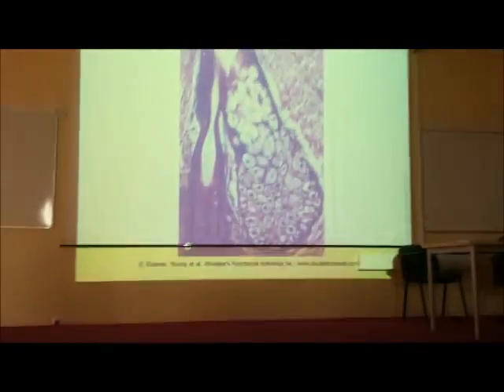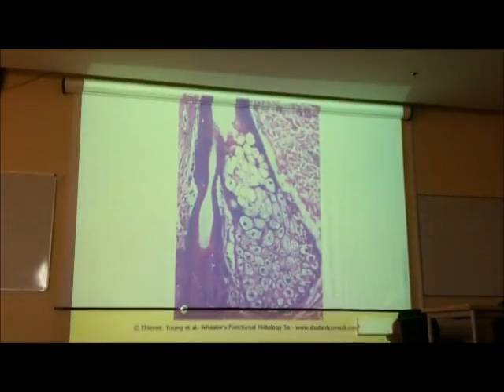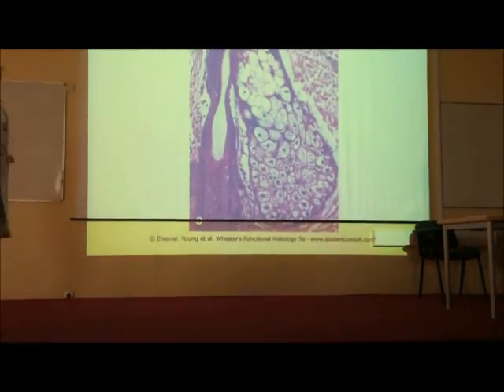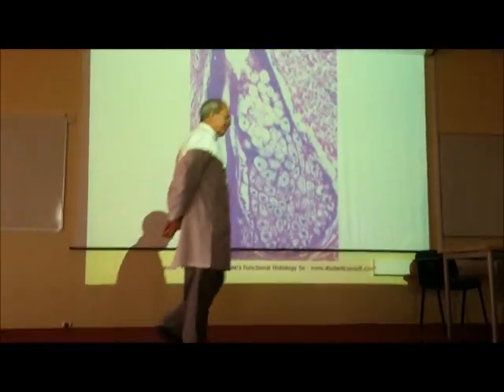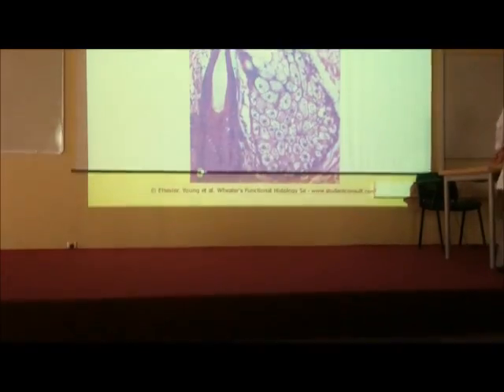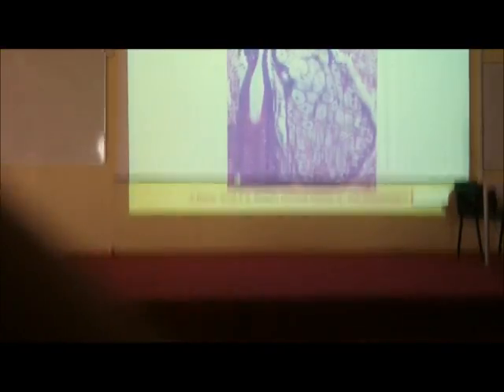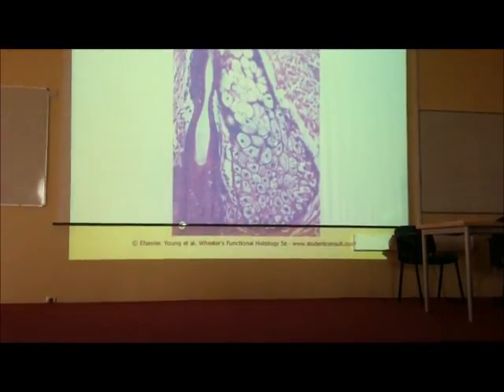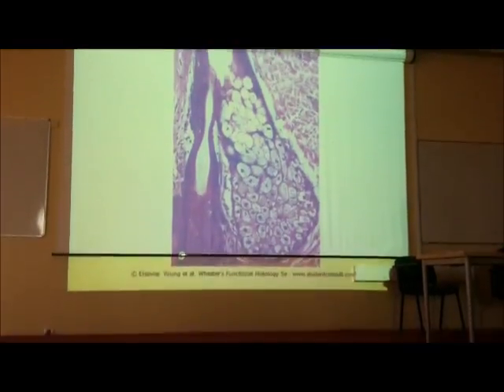What is about this gland? Simple alveolar. What is the type of their secretion? Okay, I will tell you one thing. Look to the cytoplasm. Do the cytoplasm have empty spaces?